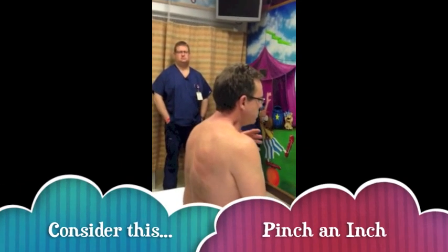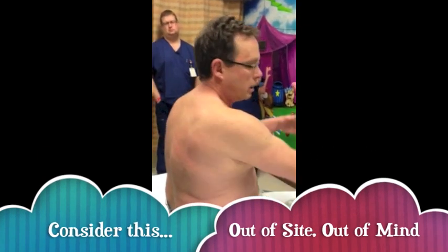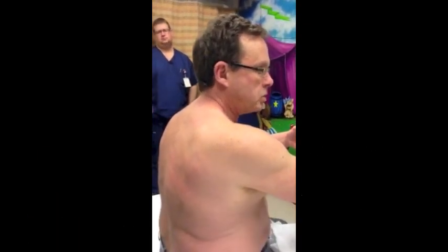The idea here is: if I were a little kid, I'd be consoled by mom. So I'm hanging on to mom, and my back is fully shown and accessible.